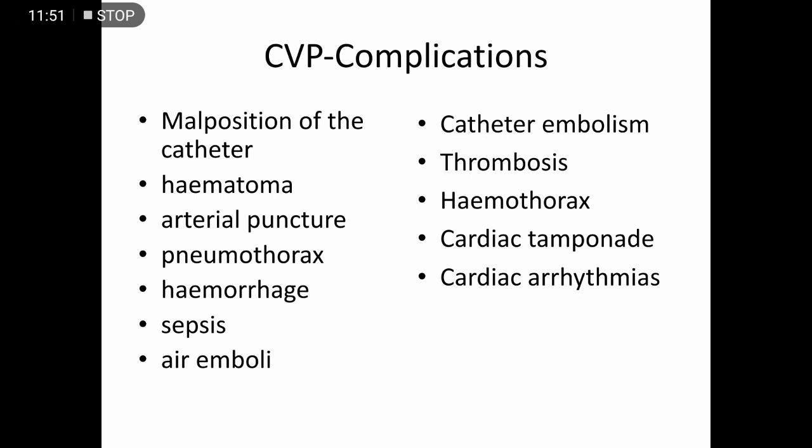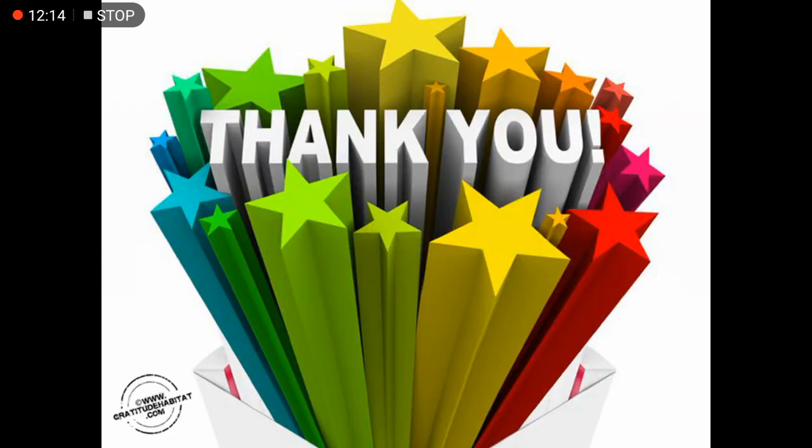CVP complications: malposition of the catheter, hematoma, arterial puncture, pneumothorax, hemorrhage, sepsis, air emboli, catheter embolism, thrombus, hemothorax, cardiac tamponade, and cardiac arrhythmias. Thank you very much for your attention.